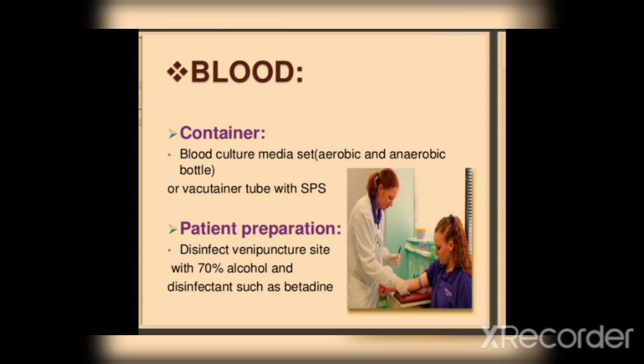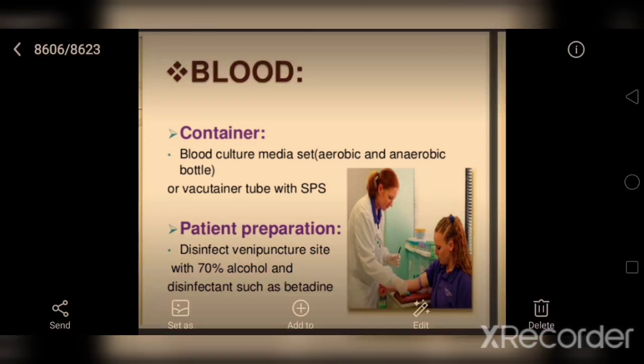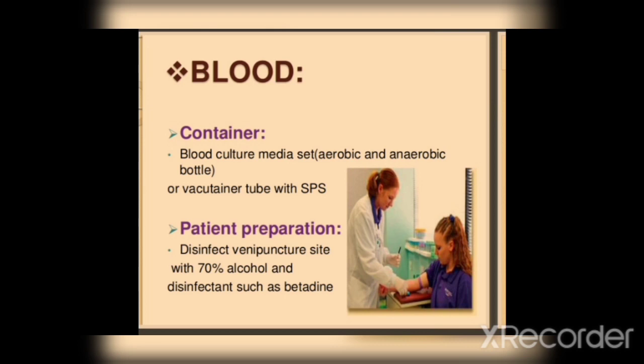We are going to take samples for blood culture. Blood culture media can be aerobic or anaerobic. We use a vacuum tube with SPS — sodium polyanethol sulfonate — or a liquid tube. When we are at the hospital, we disinfect with 70% alcohol.